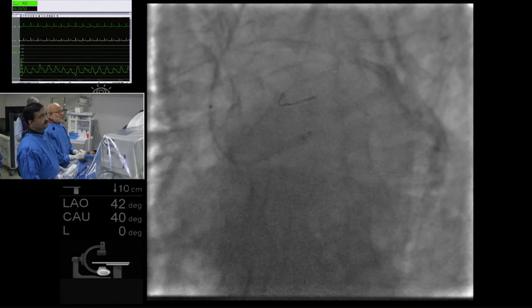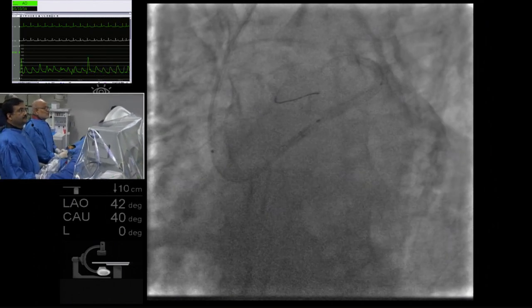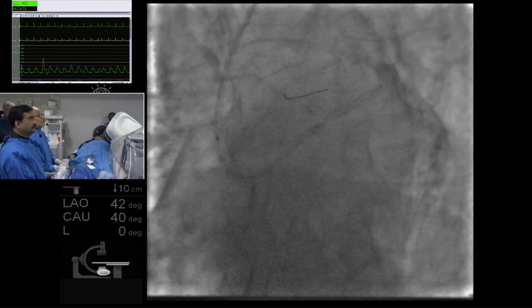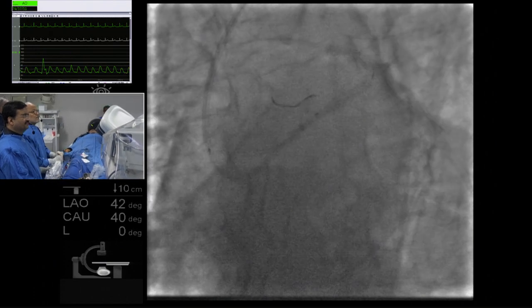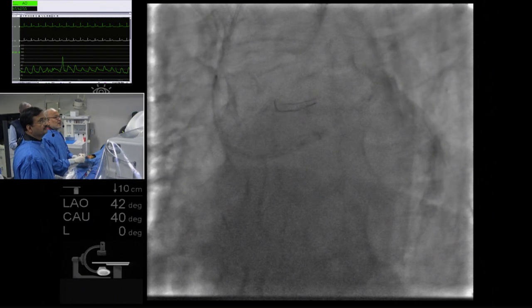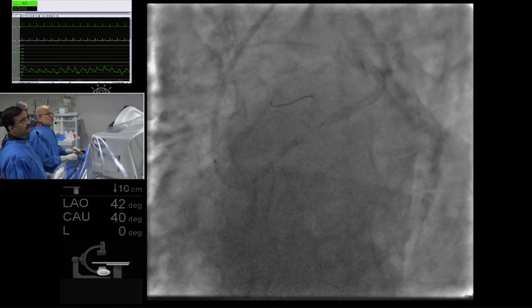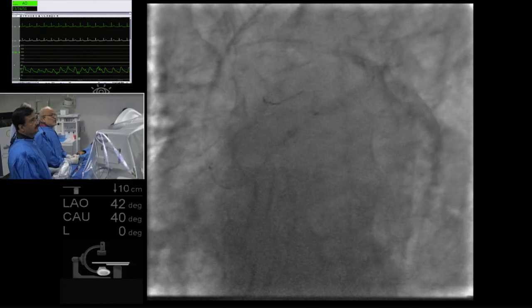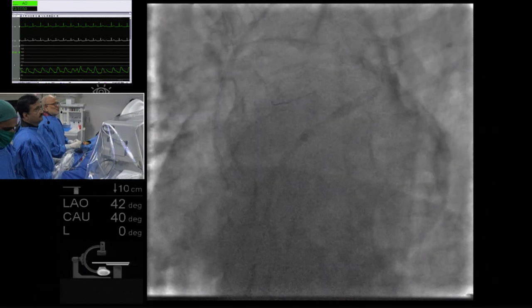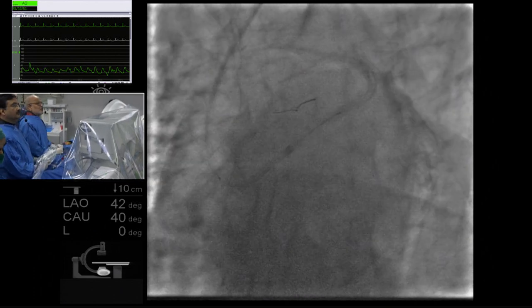Again the same thing. Again I will do some. Oh, if it doesn't work, I don't know. No. Pull everything back and go again. It went a little. Guiding is constant pressure. No, it's not working. Any suggestion? John. No, then what I will do is I will hand over this thing to Tak. Oh, it has gone. Gone. Hopefully. Gone. And then I will struggle here.